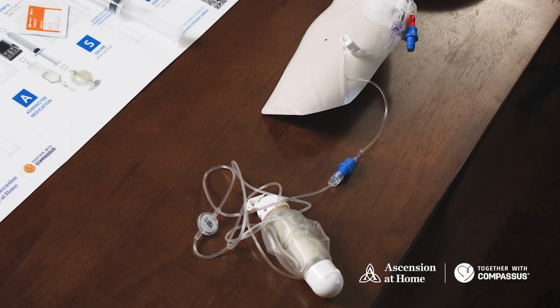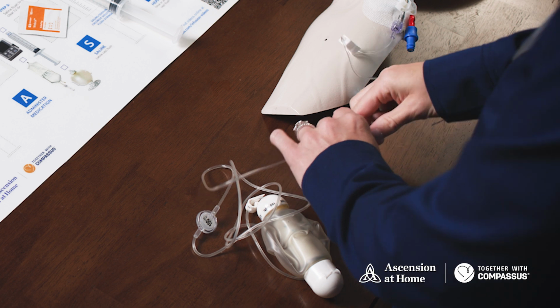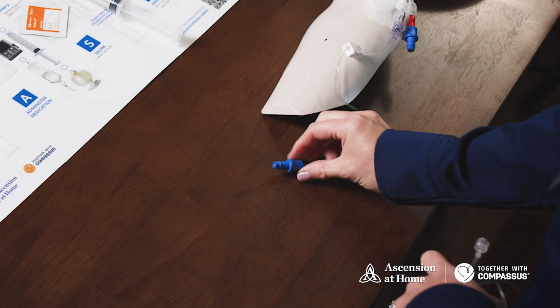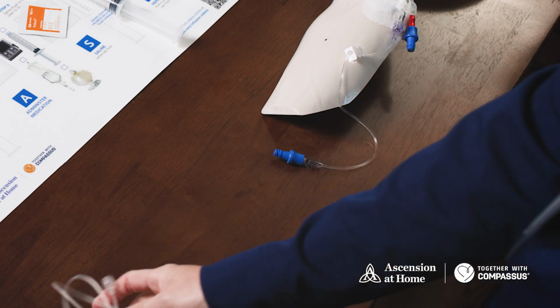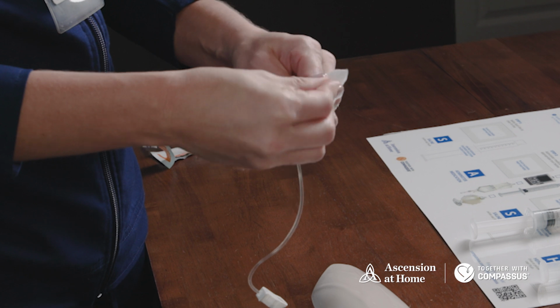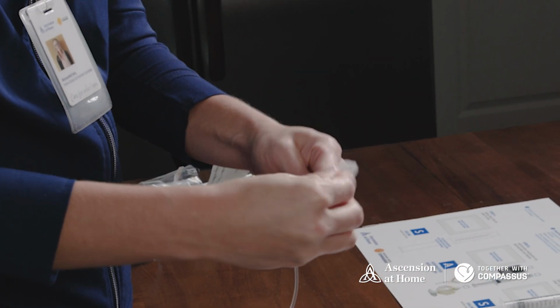When the medication has been administered, clamp the tubing on the extension and the pump, remove the elastomeric pump, and discard it into the trash. Be mindful not to touch the clave. Pick up the next alcohol wipe and scrub the clave for 15 to 30 seconds and allow it to air dry.